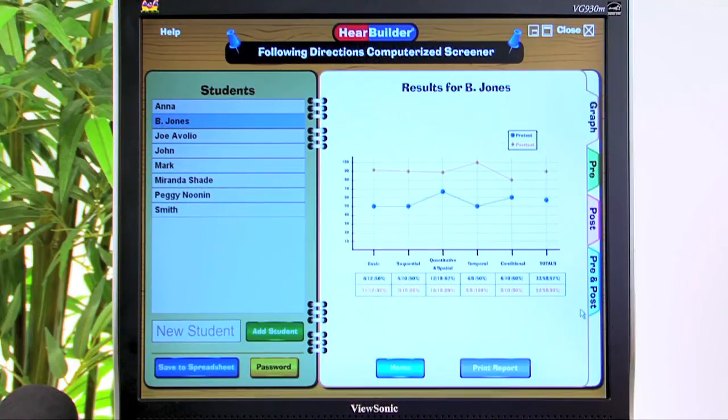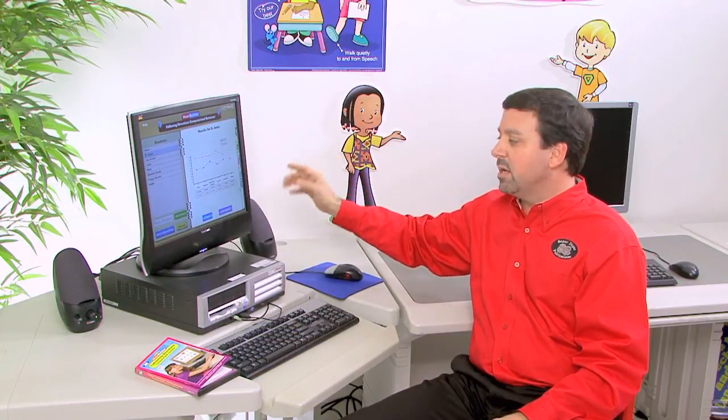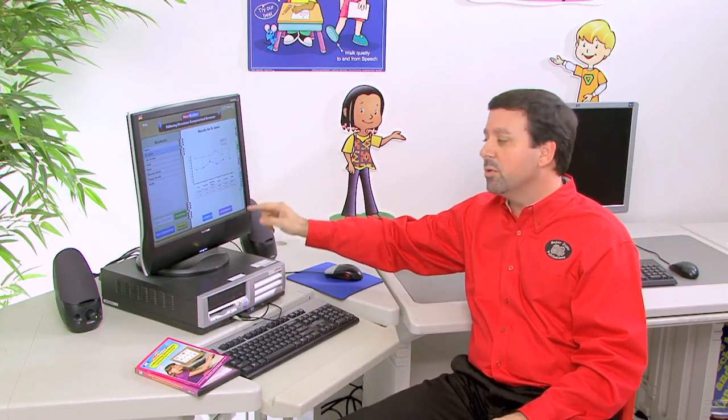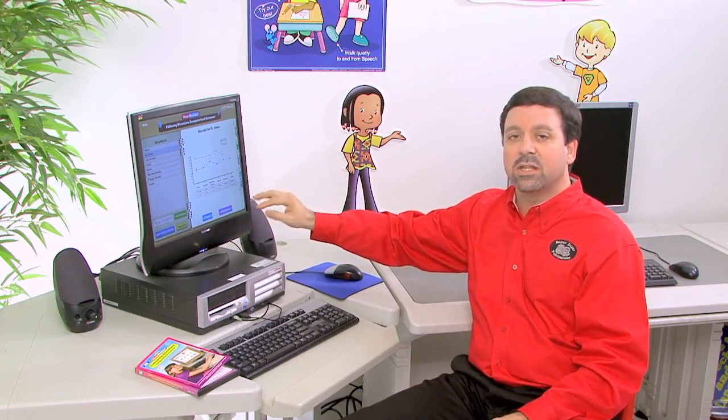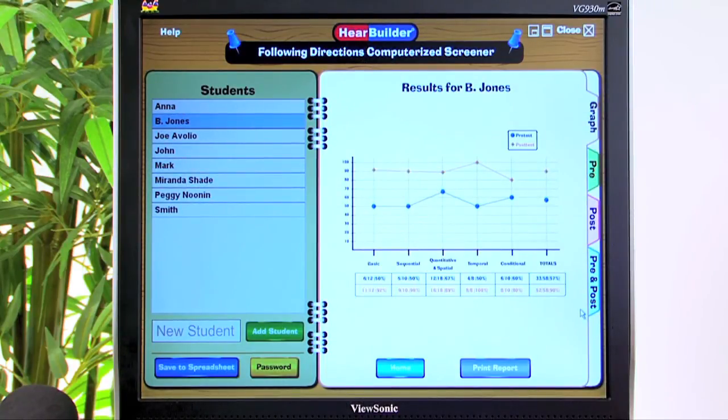To show the results, we simply click the Show the Results button, and this will provide us with a graph of each of our responses. Now you'll notice at the bottom, in blue, we have all of our percentages that are in a box form. The blue is going to indicate correct responses for the pretest, and the orange is going to indicate the correct responses from the posttest.